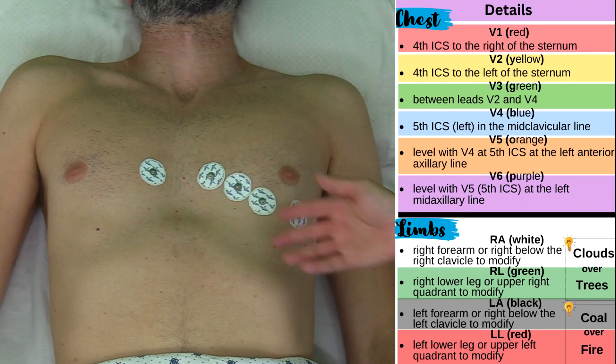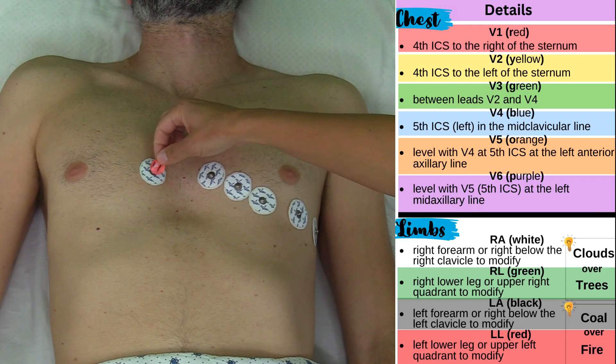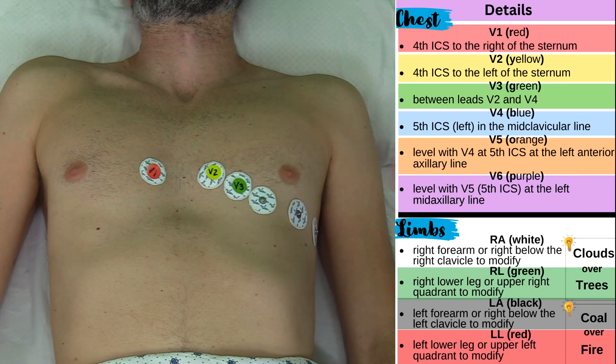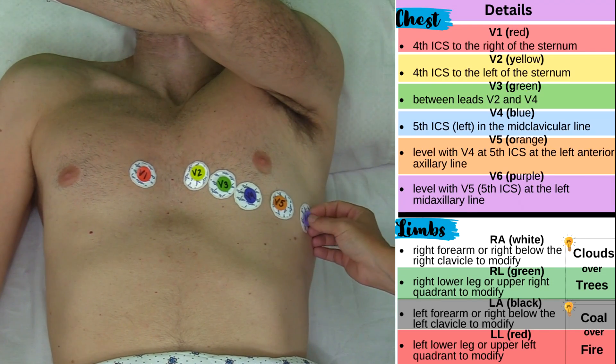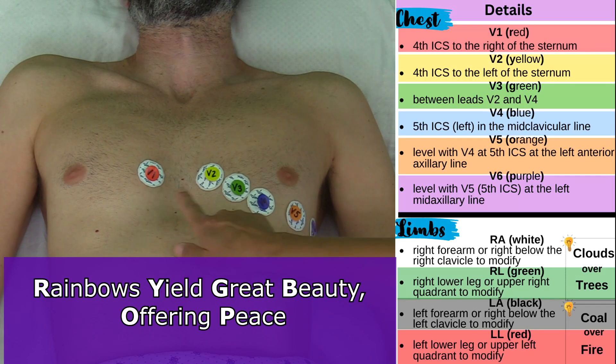Now let's go over the colors of the leads that connect to these electrodes. These colors can vary depending on the machine you're using, but typically V1 is red, V2 is yellow, V3 is green, V4 is blue, V5 is orange, and V6 is purple. To remember that, use this mnemonic: rainbows yield great beauty offering peace.